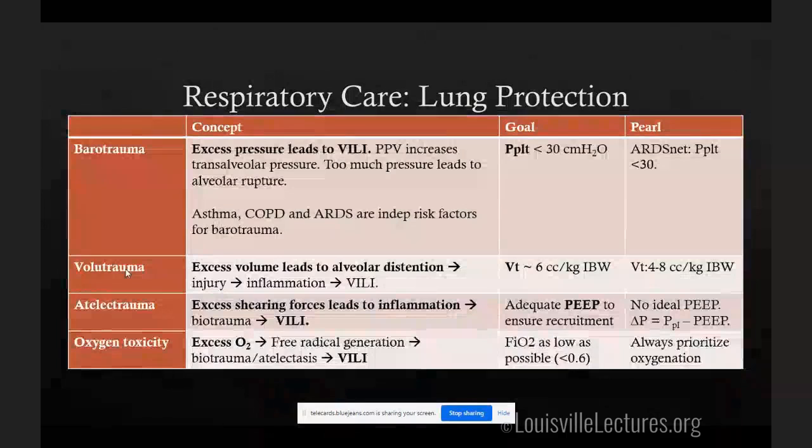We said, again, the vent is a support device, so the patients can breathe larger tidal volumes if they need to, or they feel like they're not well sedated. That's okay to an extent. In general, we accept a range of 4 to 8 cc's per kg of ideal body weight. And there's a nice calculator on MD Calc that can help calculate that for you.